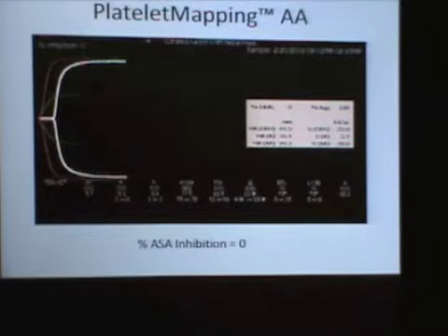Now here's how we can help these patients. If they're hyper on both ends, the thrombin side and the platelet side, the strategy is to put them on an anticoagulant, Lovenox or heparin, preferably heparin. You get an effect right away. If your R time lengthens and your MA narrows, then we know it's thrombin based causing this hyperness. If your R time goes out, you decrease the production of thrombin, and your MA stays wide, we know it's platelet based.